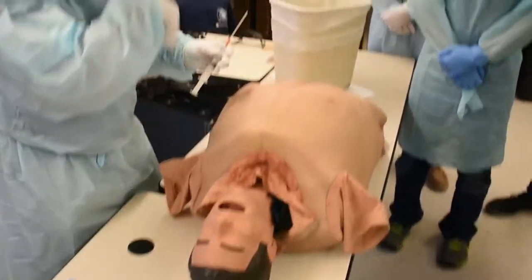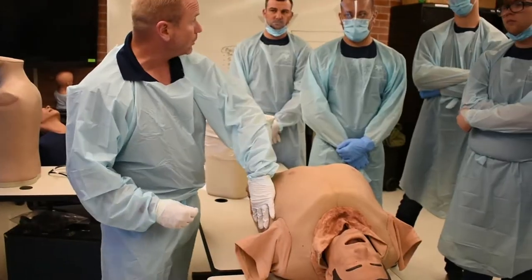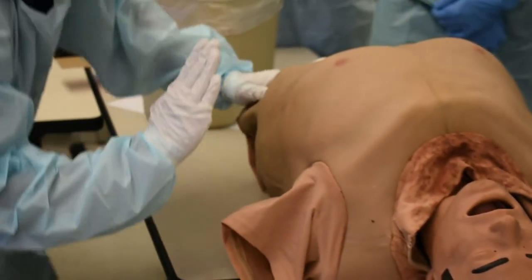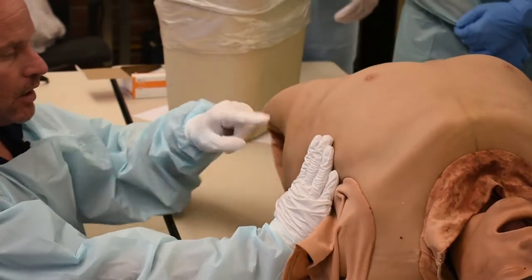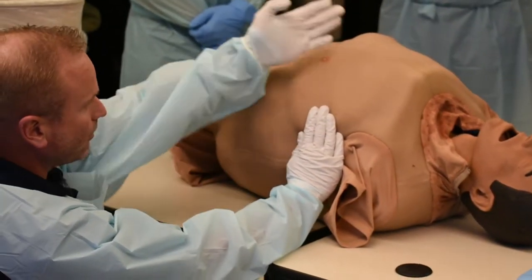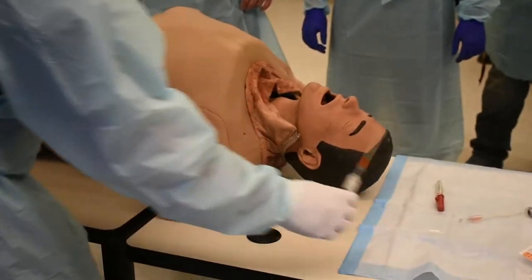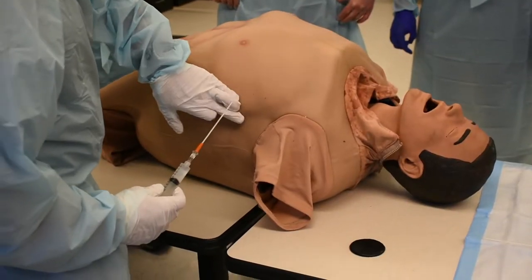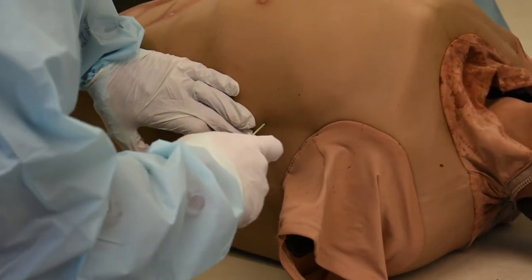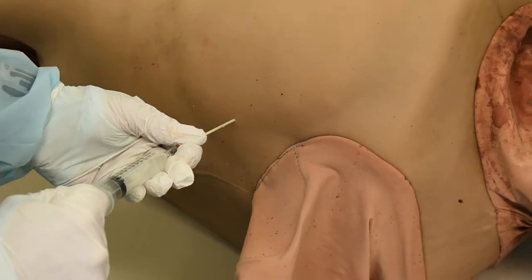Fourth or fifth intercostal space — in combat we just flip the arm up over the patient's head, just like when we do chest tubes, and that opens up that rib space. The nipple line is literally T4. You can also put your gloved hand in the axilla — my thumb happens to be right on rib four. If I know this is four, we're going into fourth or fifth intercostal space. Find the fourth or fifth intercostal space, find the rib, pull the skin down, and do everything the same way. I have my bevel up, put it through the chest, and as I go into the space, I get that nice big rush of air.